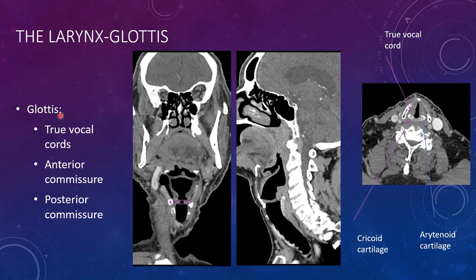At the glottis, you have the true vocal cords, the anterior and posterior commissures — which is where they meet in the front and the back. The true vocal cord is made up of muscle, so it should have soft tissue density. I like to look for the arytenoid cartilage because that's where the vocalis muscle attaches. Here's the cricoid cartilage posteriorly — posterior to that would be hypopharynx, all of this is larynx. On the sagittal view, look for those paired true vocal cords going to the midline.